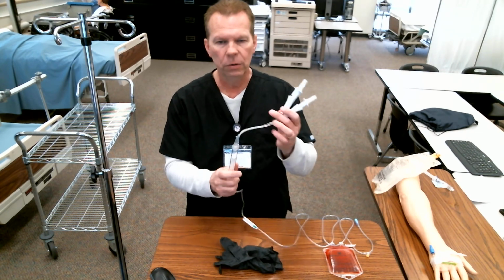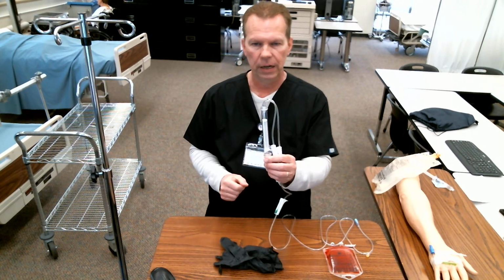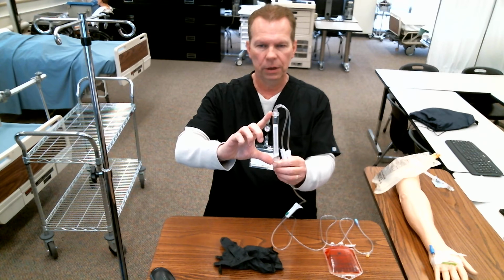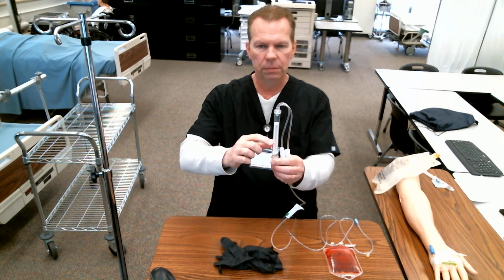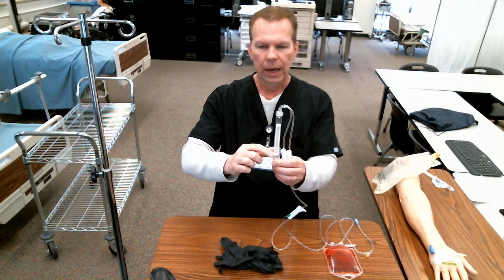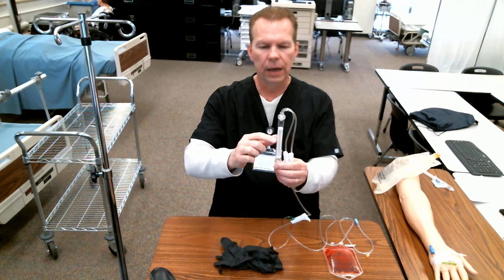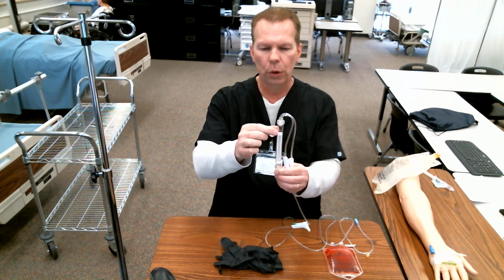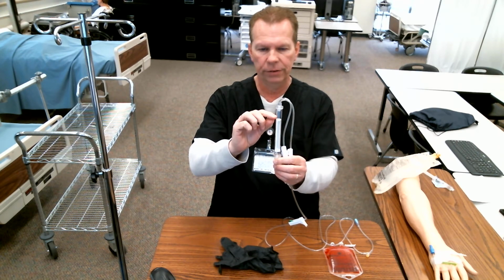All right, I also want you to see, yes, this is showing up good here, at least on my TV that I can see. You can see this big white thing. So here's a drip chamber. This is our drip chamber, just like a regular IV. This in here, this big white thing is a filter. And when I spike the saline and open the saline to purge the line, I have to get that saline all the way up over top of this big white filter here.